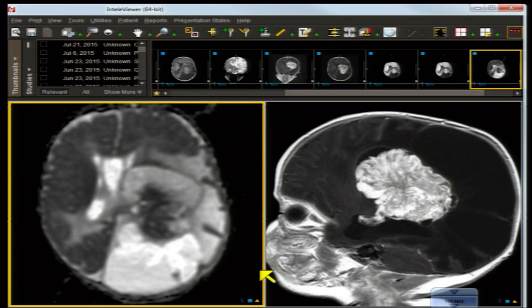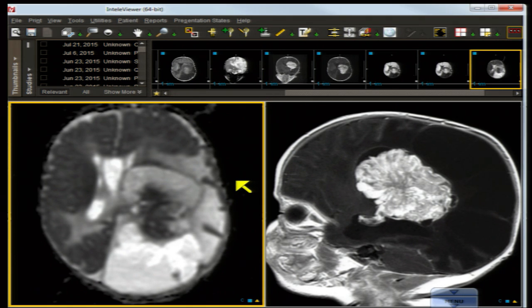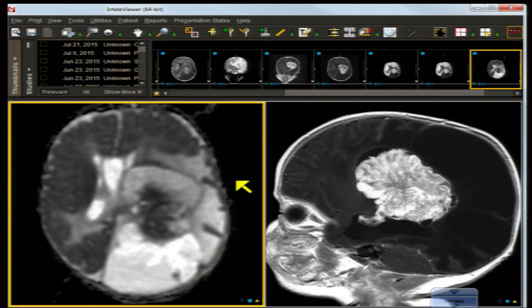They are soft, well-circumscribed, and have been likened to the appearance of cauliflower — as our case demonstrated. Histologically, when benign, they are very similar in appearance to regular choroid plexus anatomy. Hemorrhage and cyst formation may be seen — there are cysts associated with our tumor, which can be misconstrued as trapped ventricular tissue. They only calcify about 20 to 24% of the time, so the choice of 90% calcification rate is incorrect.